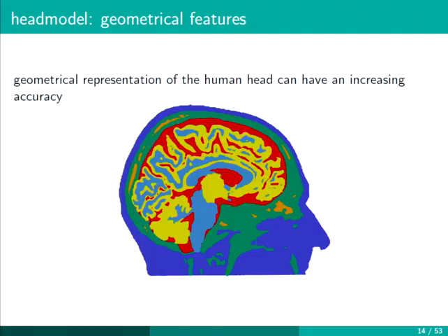Is it possible to perform a multimodal segmentation? For example, you have the CT and the T1, when it's a fusion image, then you base your segmentation on all three, or you have to essentially pick one? You can combine results and you can apply the same pipeline to each image, I would say. And then you can use MATLAB functions to combine the results that you get. But as far as I know, there's not one unique function where you can fit in all the images and will do all the job for you.